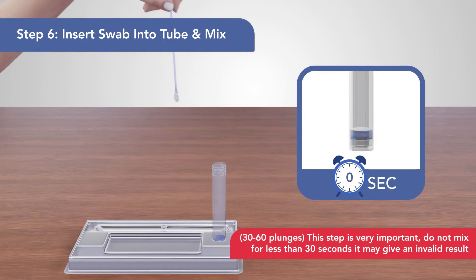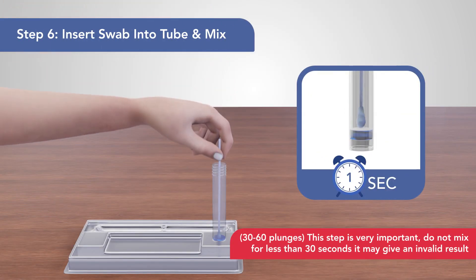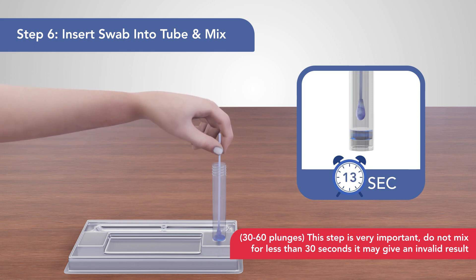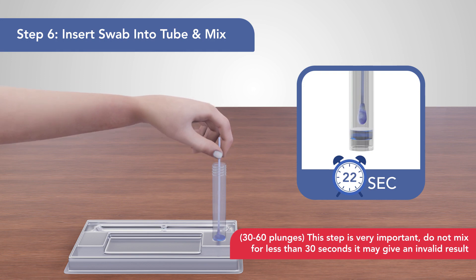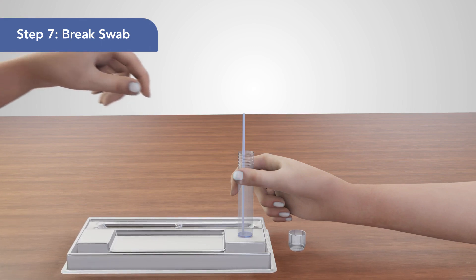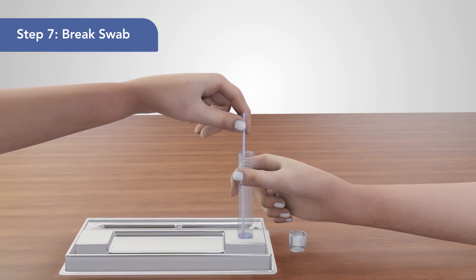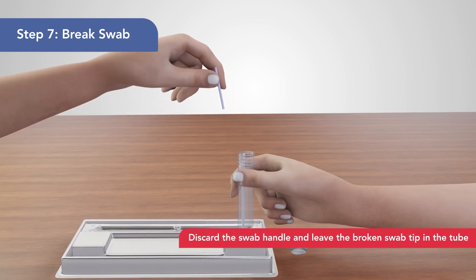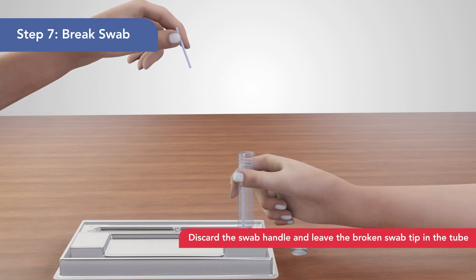6. Completely submerge the swab tip inside the tube and set a 30-second timer. Make sure to thoroughly mix the swab tip by plunging repeatedly with the buffer solution that comes with your kit. 7. Make sure that the swab tip is inside the tube. Hold the tube with one hand and carefully break the swab handle against the side of the tube using the other.